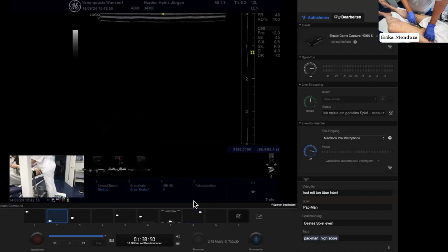Okay, so I have put 2. Do you see them? One in the saphenous vein and one in the superficial. This one. But I hope it will keep there. Because that's extremely important. And as you're saying, Dr. Erika, you need to have secure access, because if you lose that access, you've lost the opportunity to actually intervene. It's not the end of the world because you can always come back and do it, but you really must ensure that you've got secure vascular access.